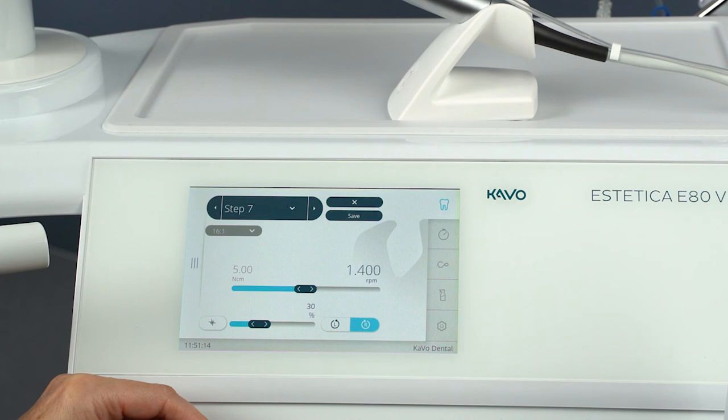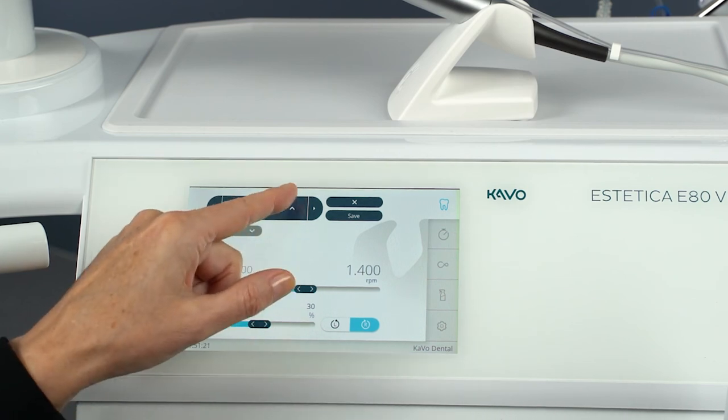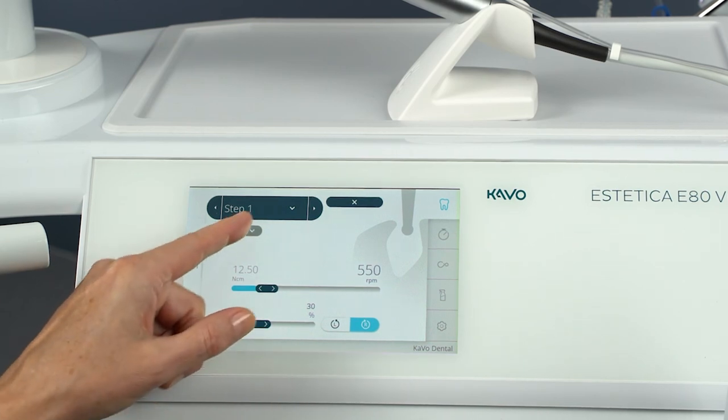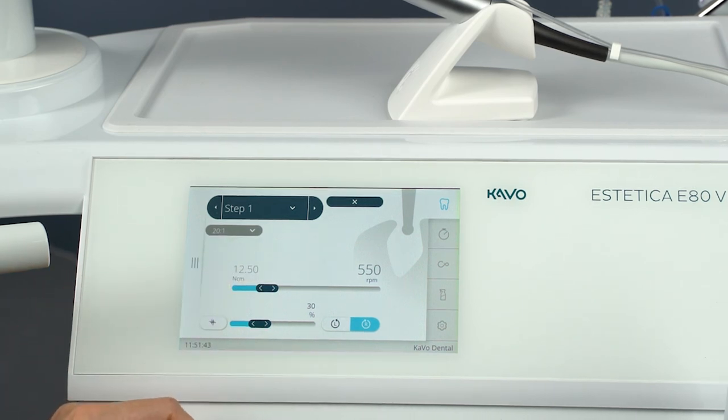The integrated one-touch calibration automatically compensates for motor torque deviations that can be caused by aging processes, for example. Stiff or defective instruments can be detected before use. The one-touch calibration thus ensures a more precise torque on the contra-angle handpiece. Only carry out the one-touch calibration with the Carvo surgical instruments with a speed decrease of 16 to 1 or 20 to 1. Hold the motor in your hand during calibration or place it securely on the instrument tray. Please also observe all information regarding the instruments that can be used in the instructions for use.